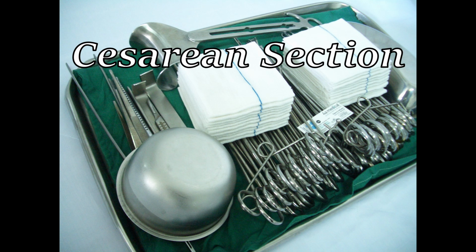Step 6. Abdominal wall closure. Hemostasis is confirmed. The bladder flap may be reapproximated with fine absorbable suture, and the peritoneum is often left open, but can be closed based on surgeon preference using absorbable suture. The fascia is closed with a running locking absorbable suture, typically number 1 PDS or Vicryl. The subcutaneous layer may be reapproximated if thicker than 2 centimeters to reduce seroma risk. The skin is closed with staples or subcuticular suture using a 5-0 Monocryl on a PS2 needle. Pearl. Subcuticular closure, followed by glue or Steri-Strips, may improve cosmetic outcome and patient comfort.